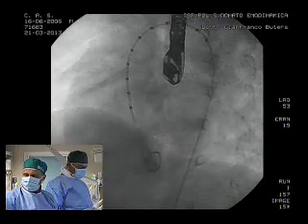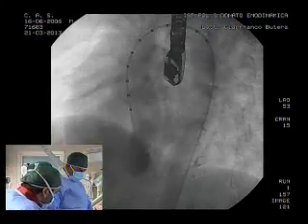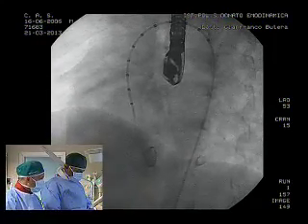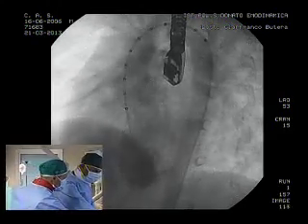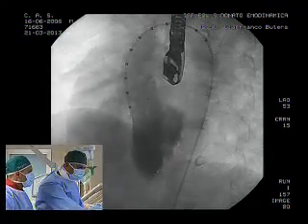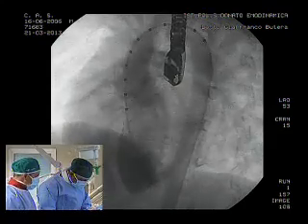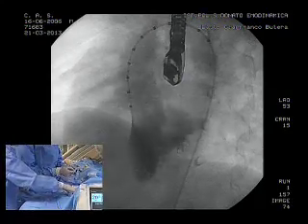Wait a second, Ziad. You have the old membranous device? Yes. Oh, I didn't know that. Okay, go ahead. I don't think this kid is at much risk of AV block. He's older. He has an aneurysmal pouch. I think the device is going to be a little bit tilted inside the pouch. I didn't know you had the previous version of my device. You are in Italy, my friend. They have everything here. Okay, then it's the best choice.